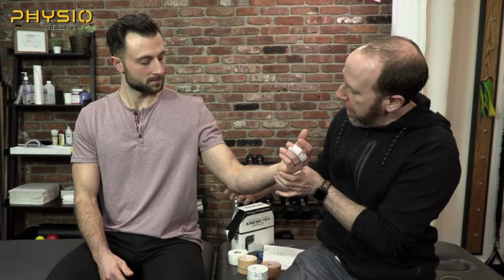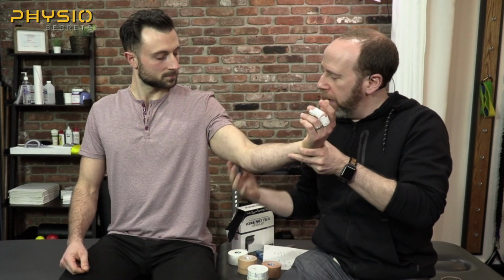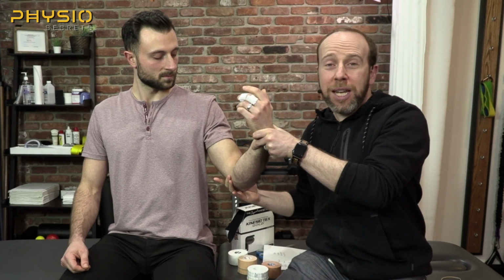We talked about tension. The next component is axis. So when you're applying tape, the axis of rotation of the joint is going to determine whether the tape goes on stretch when the joint is in extension or flexion. So for example, if we look at the elbow, right? If I apply a piece of tape down Andrew's arm on the inside and I cross his elbow, but I cross anterior to the joint line, when his elbow goes into extension, I'm going to get tape tension. When his elbow goes into flexion, I'm going to get less tape tension.